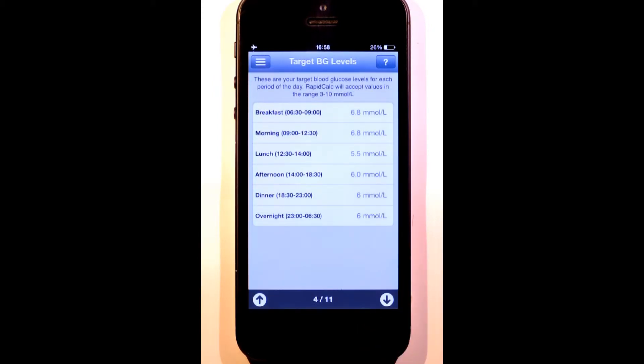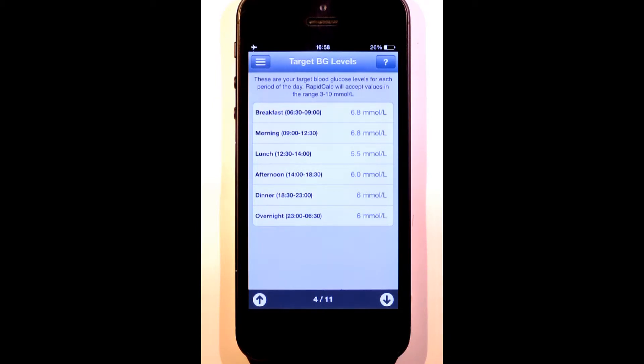The next section is target blood glucose levels. This is where I set targets for each of the time periods we've just defined. A good starting point if you're new to RapidCalc will be to set all of these to the middle of your ideal range and refine them as you go. In my example, this will be 6.5 mmol per liter.